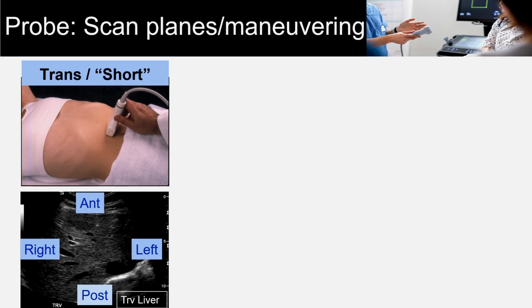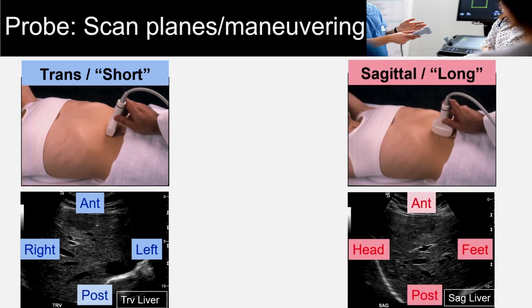When you rotate the transducer by 90 degrees, remember the red dot goes towards the patient's head. So go clockwise, rotate it 90 degrees. That part of the image that's closest to the transducer is always at the 12 o'clock position, named anterior abdomen. The part of the image that goes towards the spine is posterior, or at the 6 o'clock position, right? So we see the diaphragm as this echogenic structure over here.